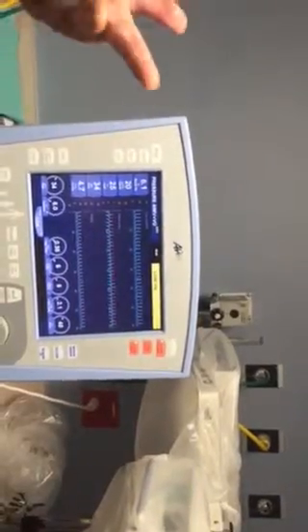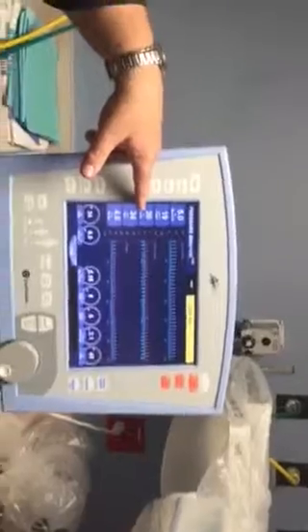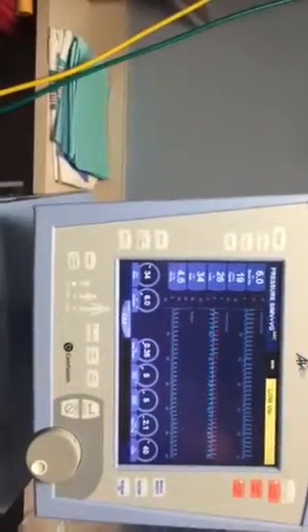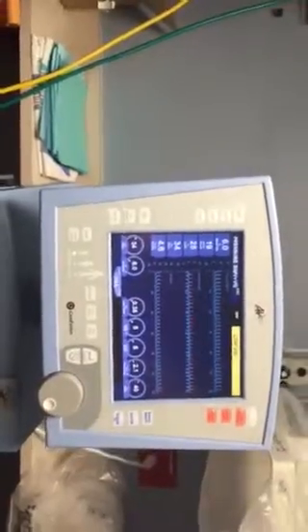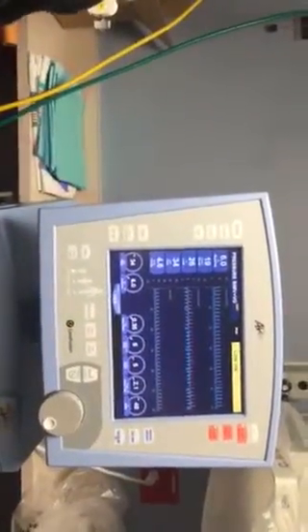The only babies I wouldn't use this on are babies with big leaks. Now 26 is not terrible, but if there's more than a 65% leak, I wouldn't even bother using this, because the algorithm gets really dumbed down. It's just not going to be worthwhile.